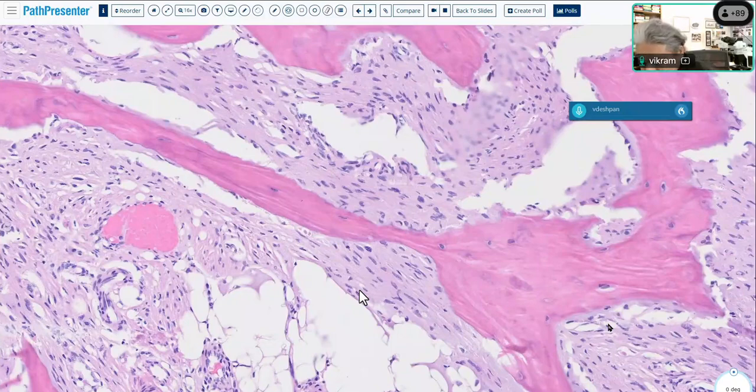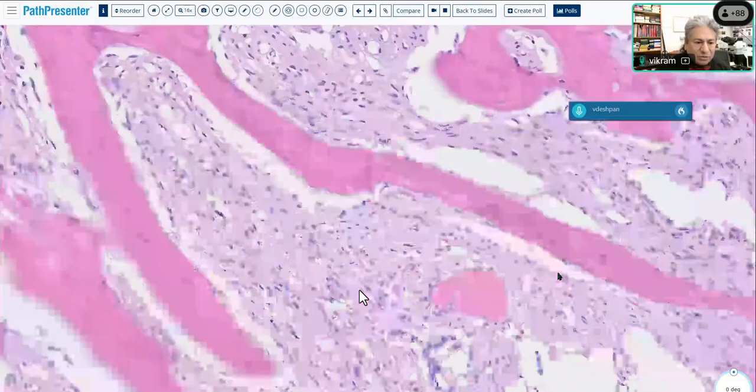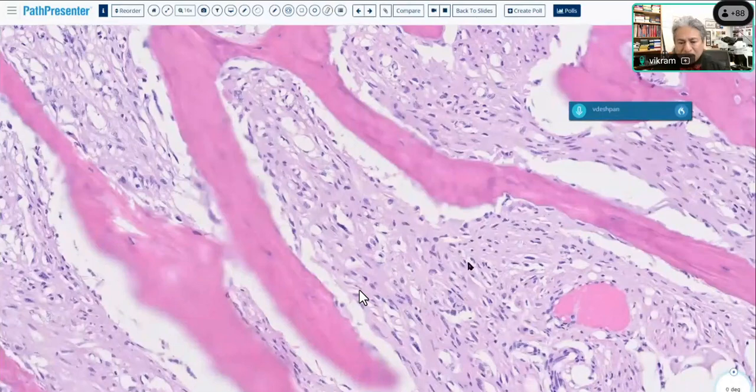Well-differentiated osteosarcomas, which is an intraosseous entity, and parosteal osteosarcomas, which is a surface entity, both of them could be associated with lamellar bone, and that's something really important to realize. So when you look at lamellar bone, a little bit of fibrous tissue, you might mistake this for a benign process, but on imaging, it would be completely different.